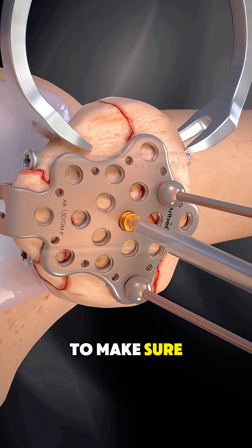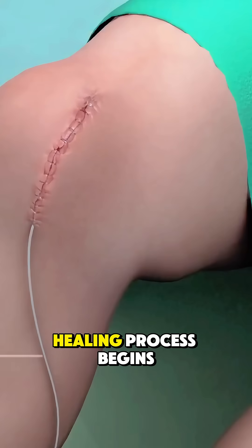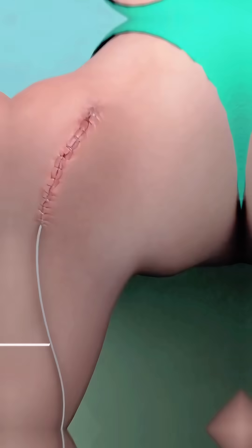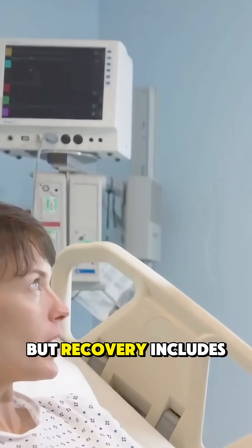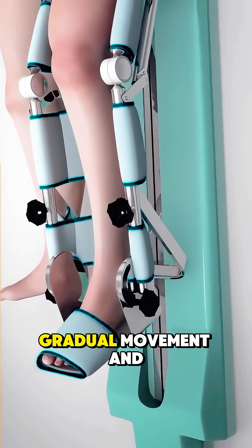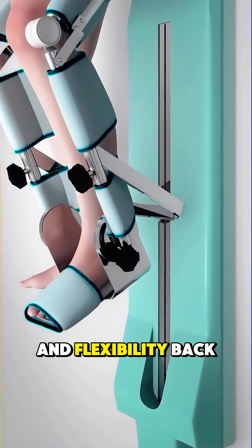The knee is then checked to make sure the joint moves smoothly, the incision is closed, and the healing process begins. The surgery typically doesn't take very long, but recovery includes rest, gradual movement, and physical therapy to get strength and flexibility back.